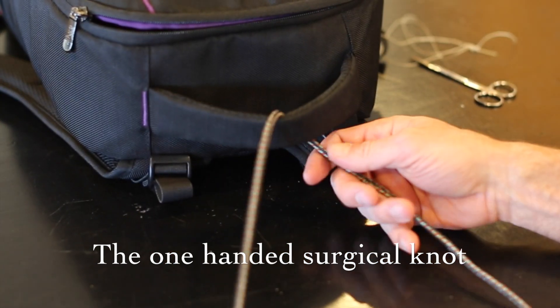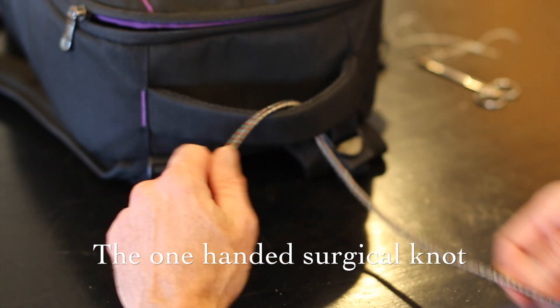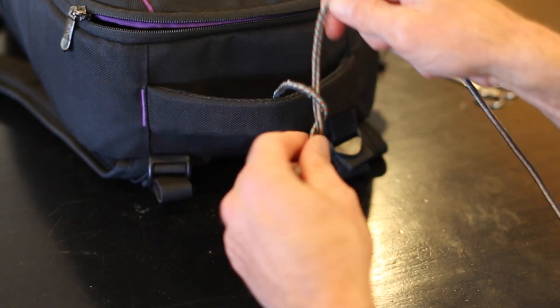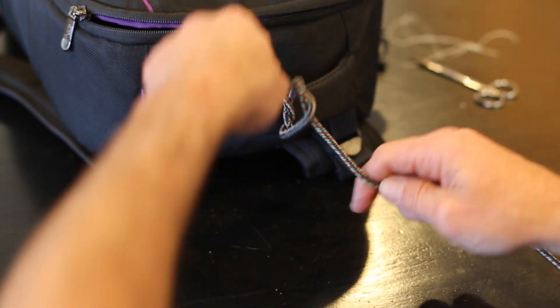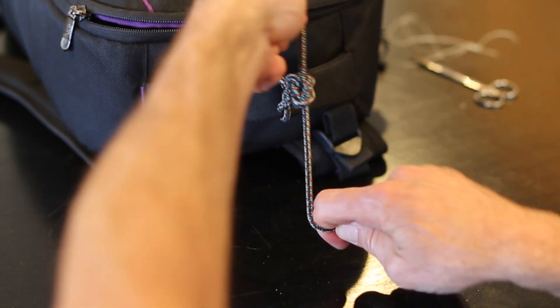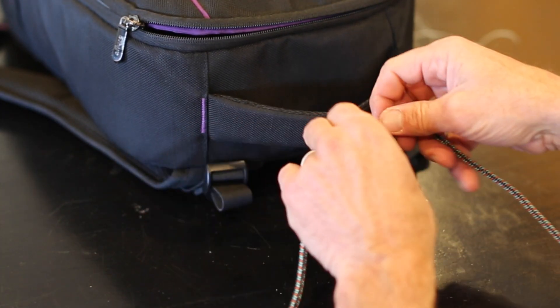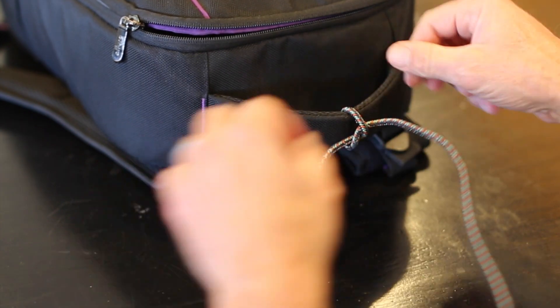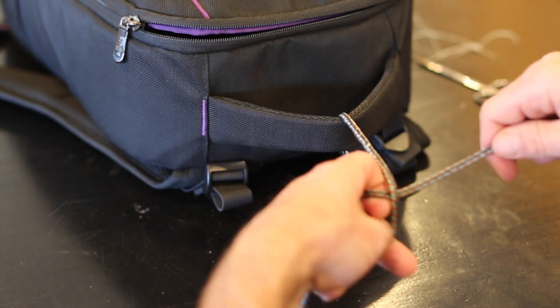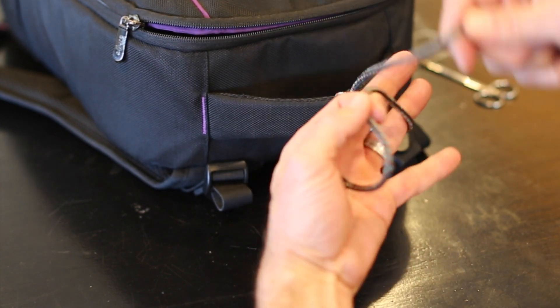I've heard so many times 'don't start with a one-handed tie,' but I feel like it's whatever works best for you. You're tying in so many different circumstances, it's just whatever is the quickest for you — it's the same result. I almost exclusively use one-handed ties.